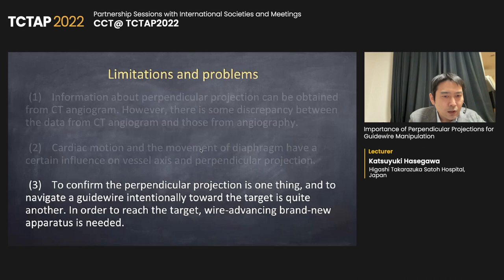And third, this is the most important issue. To confirm the perpendicular projection is one thing, and to navigate a guide wire intentionally towards the target is quite another. In order to reach the target, a brand new wire advancing apparatus is needed.